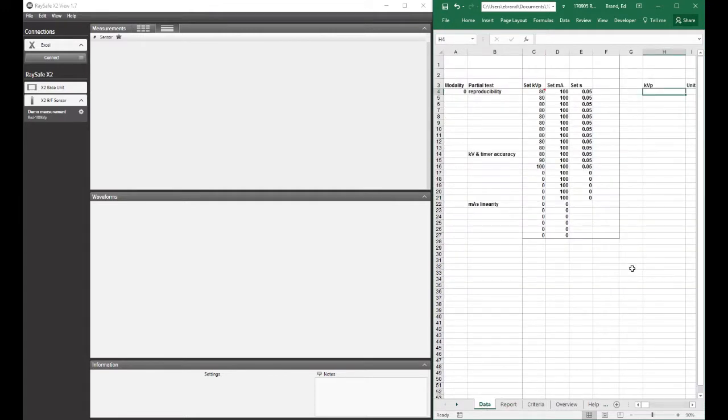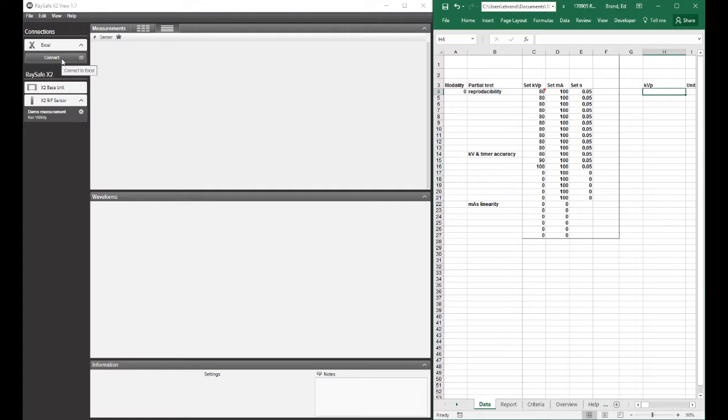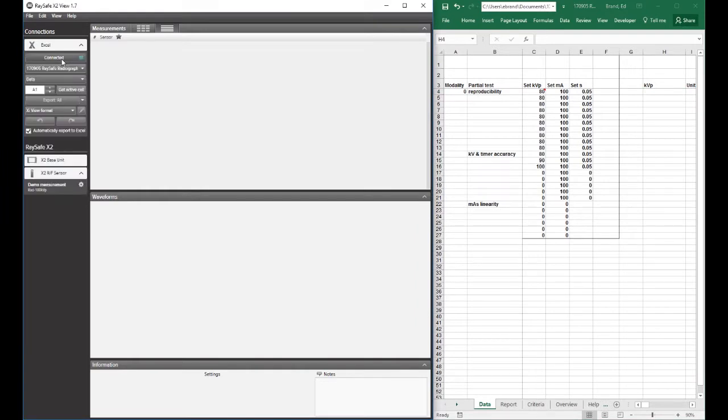So I'm going to click on the report sheet, and then back in X2View, the first thing I have to do is connect X2View to Excel. After I do that, I need to select a workbook.